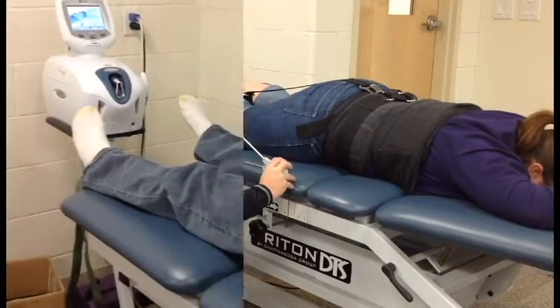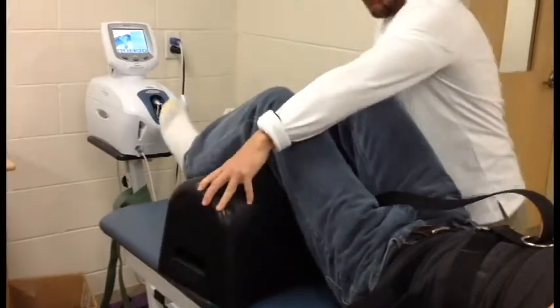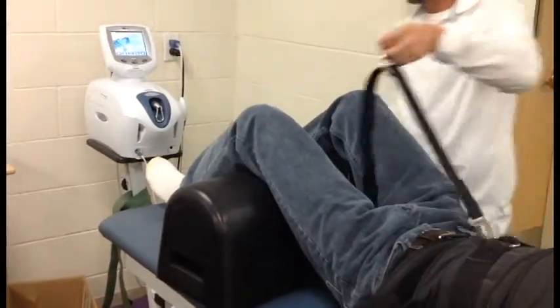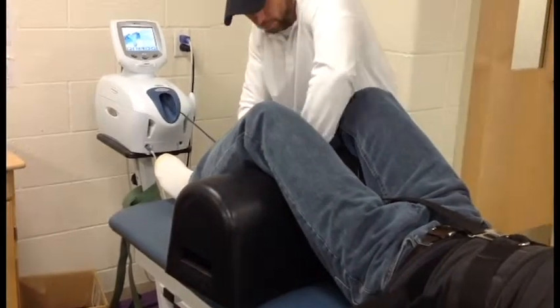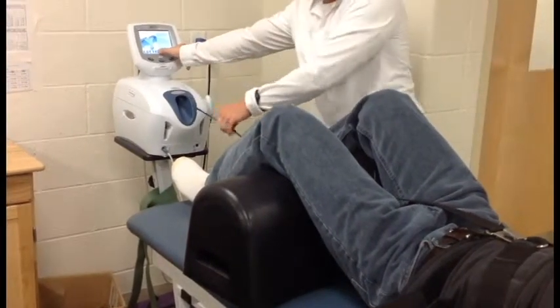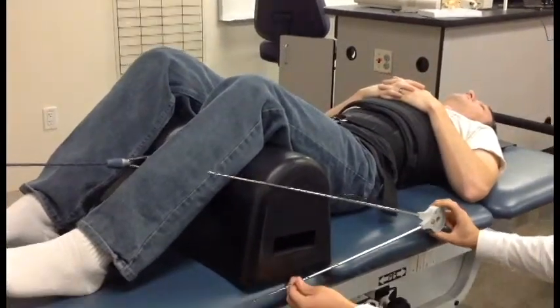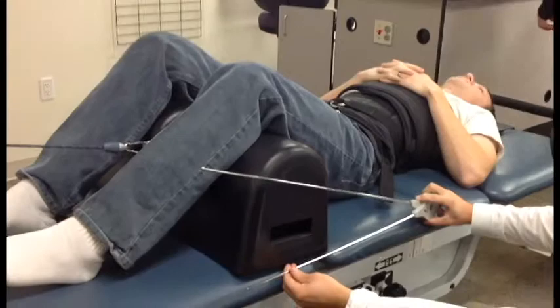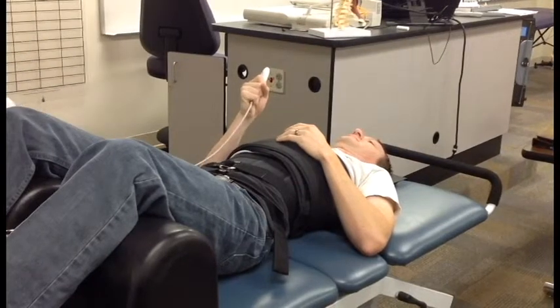When the patient is in the supine position, bolsters should be placed under the patient's knees, and the traction rope should be connected to the ring on the long strap between the patient's legs. Once connected, the slack on the rope should be removed. Adjust the height of the table to ensure a proper angle of pull, which should be about 25 degrees. The interrupt switch should be given to the patient in case of apprehension.